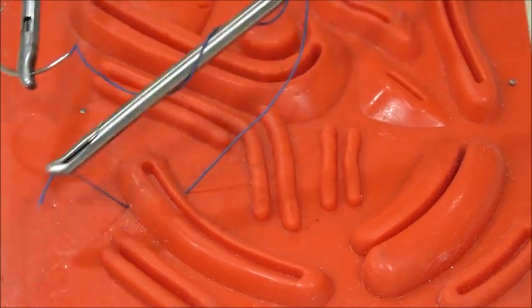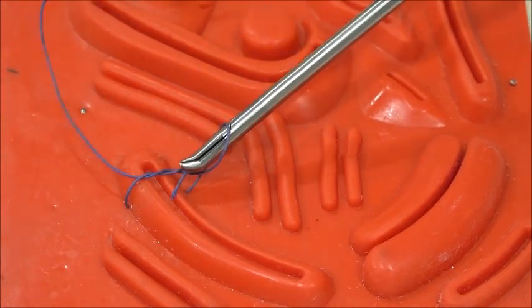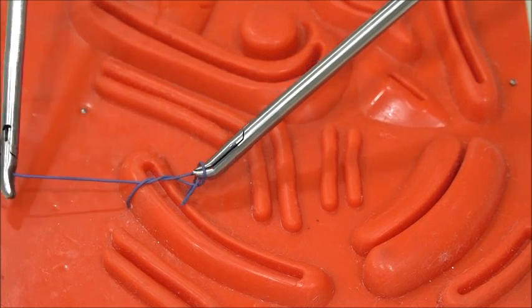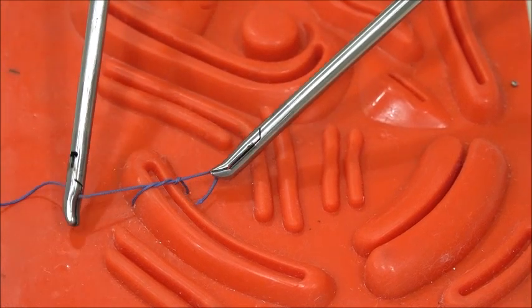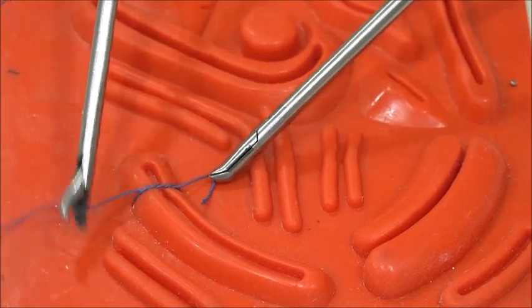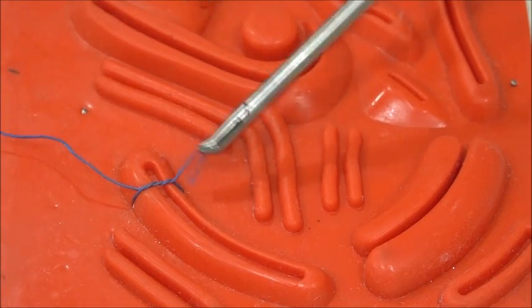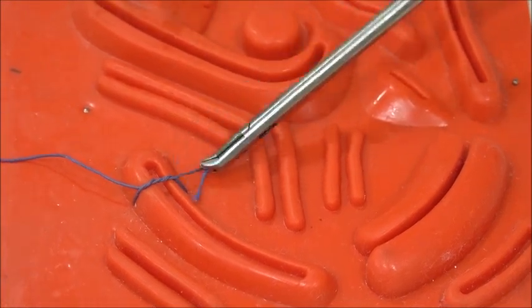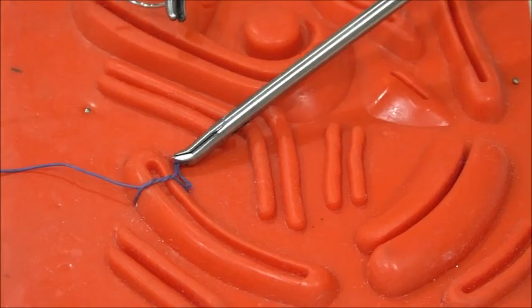In hold needle technique, see the right grasper will hold at the base, and the needle direction should be aligned to the left needle holder—should be close to the left needle holder for tying. Very comfortable for beginners. We always teach this technique for beginners.